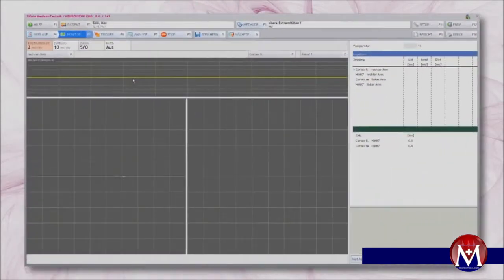The device setting for the MEP should be chosen as follows: amplification 2 mV per division.